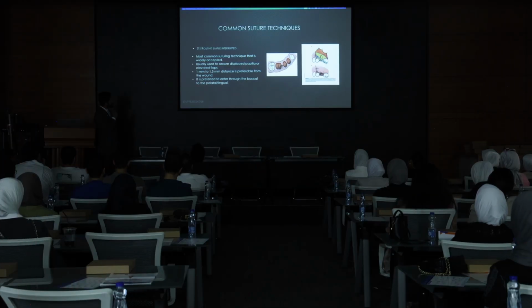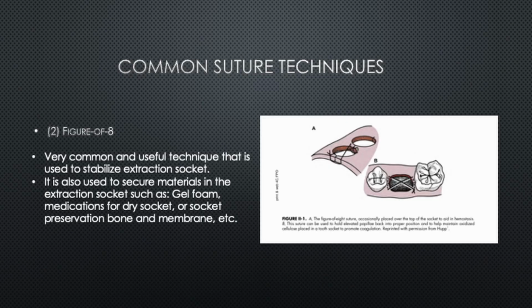It's usually used whenever you have a displaced papilla or you elevate flaps. Usually it's 1 millimeter to 1.5 millimeters distance from the wound. It is preferred to enter from the buccal towards the palatal or lingual to place the knot on the buccal side. The second one is the figure of 8, as you might of course know.